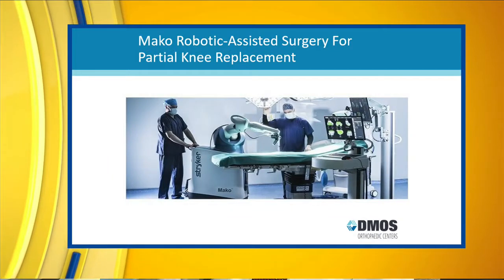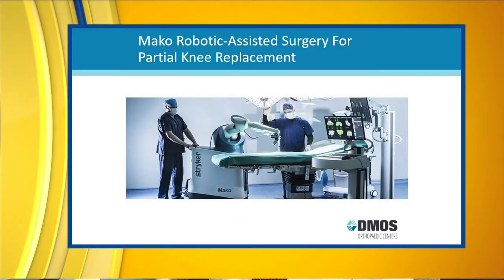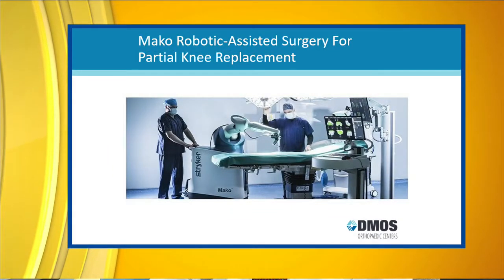So robotic assisted surgery is where the surgeon has a robot to help him do the surgery more precisely as opposed to doing something manually. We still make the incision, we still expose the joint in this case, but the robot helps us make sure that we get the implants exactly where we want them to be.